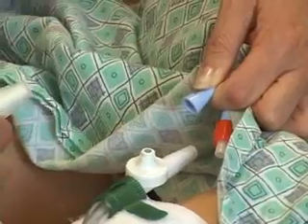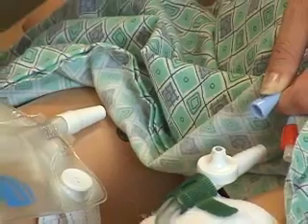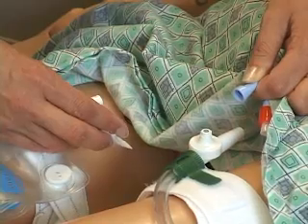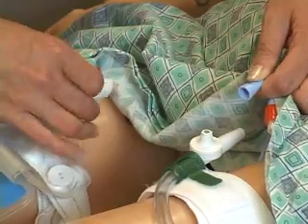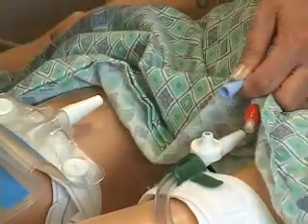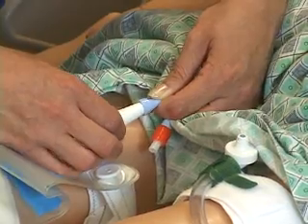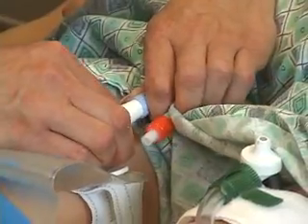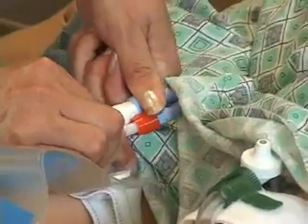While still holding this in place, remove the cap from the leg bag. It's very important to try to not allow these ports to touch anything. You don't want to risk getting bacteria on them to cause infection. Use your alcohol prep pad to cleanse the port of the drainage bag. And then you can just bring your catheter over to the other drainage bag, rest on the drainage bag, and then you can gently, without pulling on your catheter, attach the catheter to the leg bag.